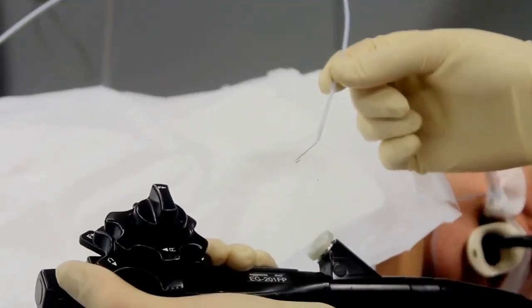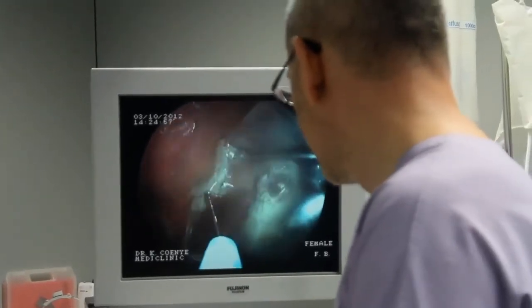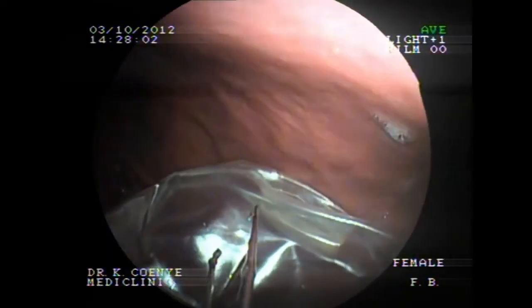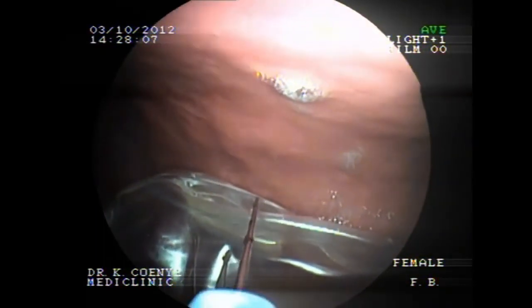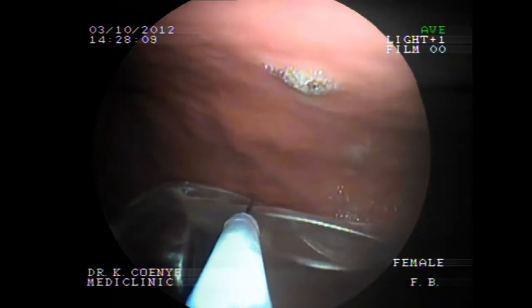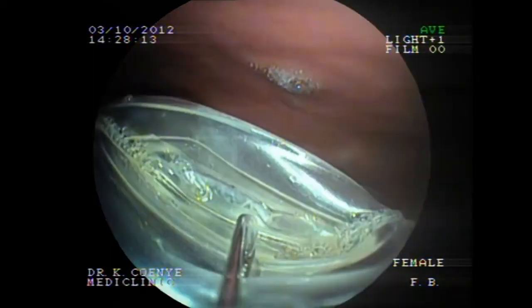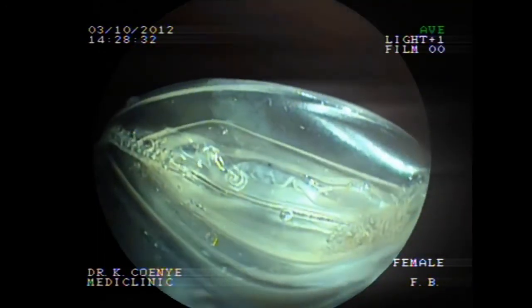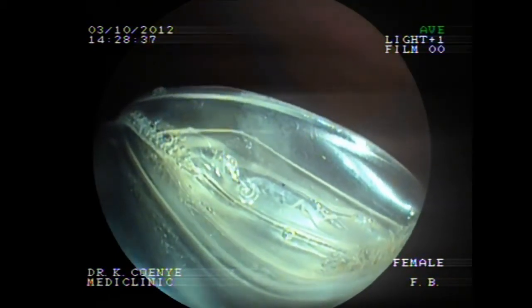Extracting the balloon. Introduce the extraction forceps into the operating channel of the endoscope, and then check that they are functioning properly. Position the extraction forceps on the most pronounced fold facing the cardia orifice and as close as possible to the blue valve. Open the forceps completely and close the jaws around the balloon fold so as to obtain a maximum grip on the material. Bring the material as close as possible to the endoscope to prevent any trauma or damage to the cardia orifice by the forceps.